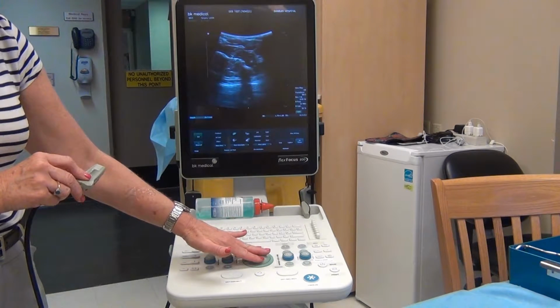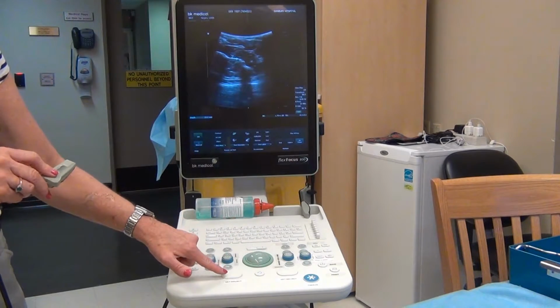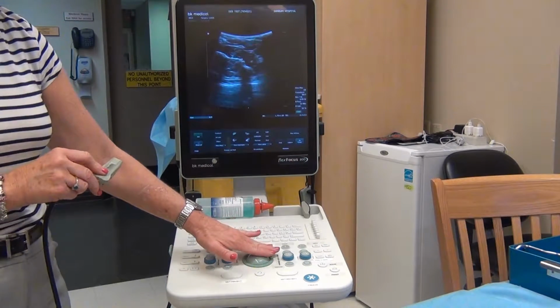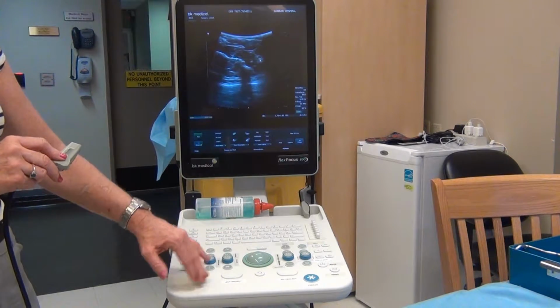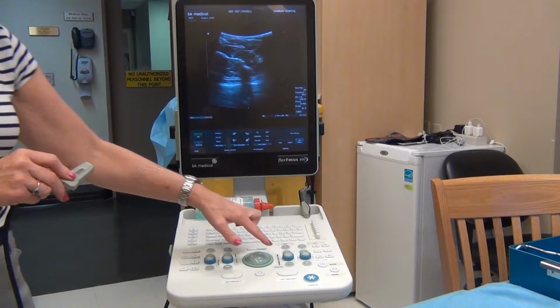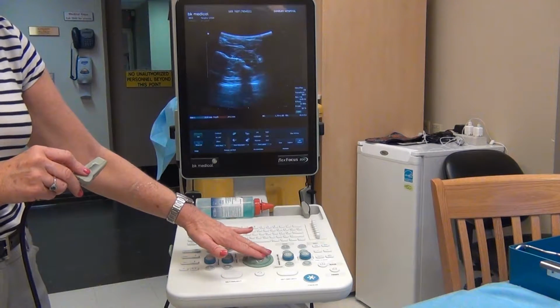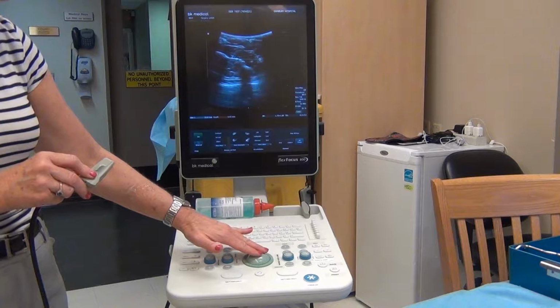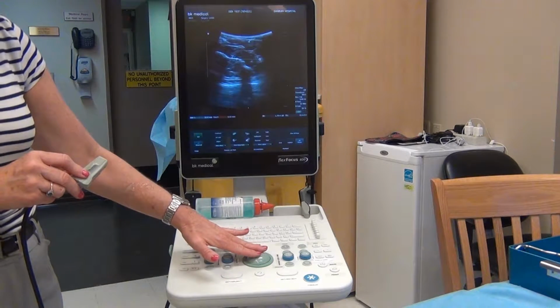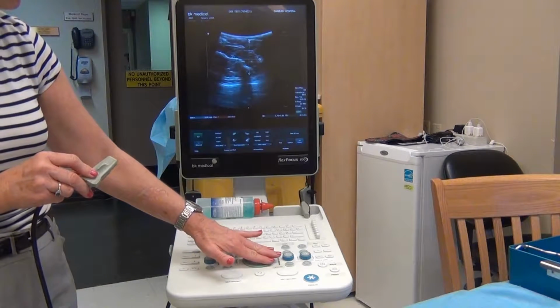What I'm going to do is move it around. I'm going to put the cursor on, say, the edge of a periphery. I'm going to set it. I'm going to move the cursor again to set the other side. Now he wants an AP measurement. Hit measure again. The cursor is hidden behind the last one. I'm going to move it up. I'm going to set it. The other cursor, I'm going to set it to the posterior side.